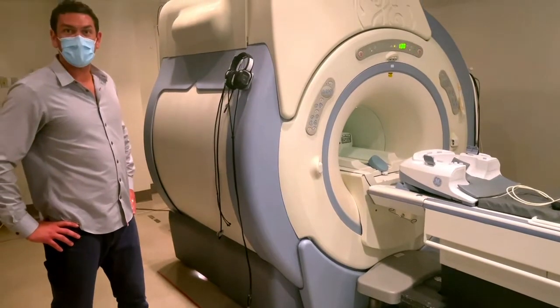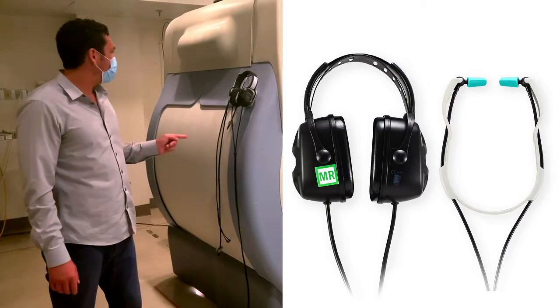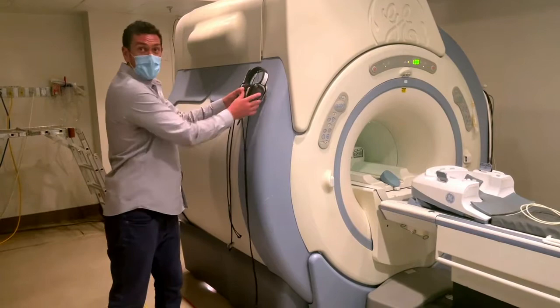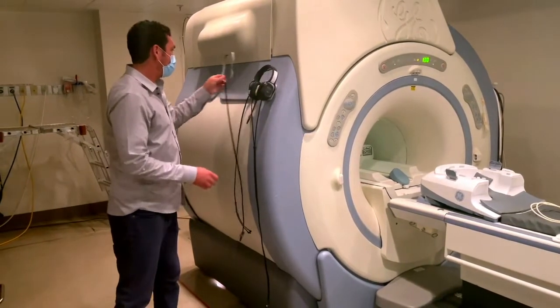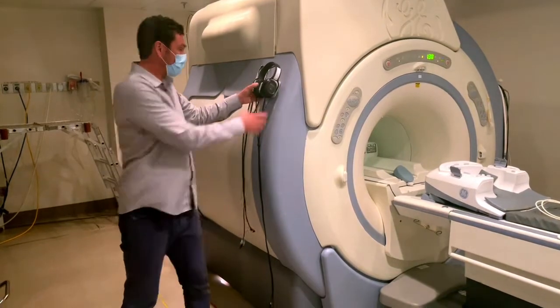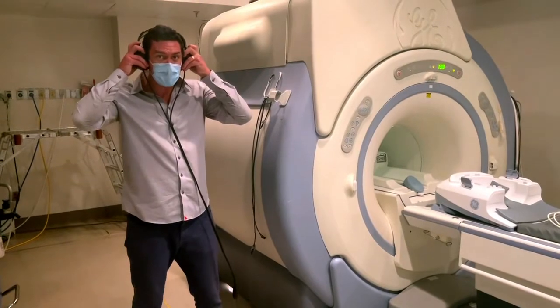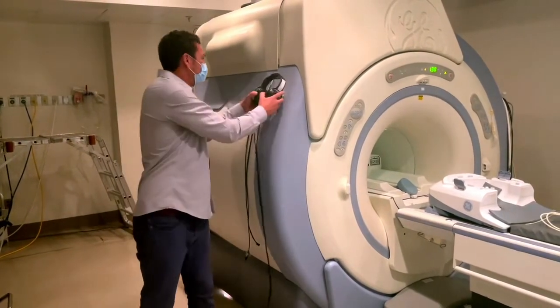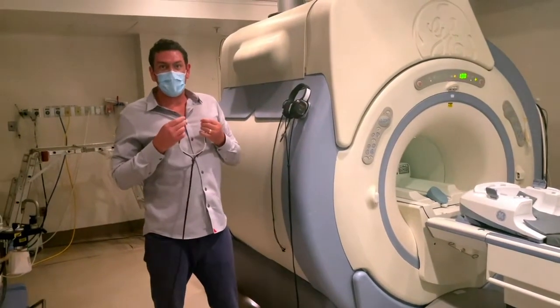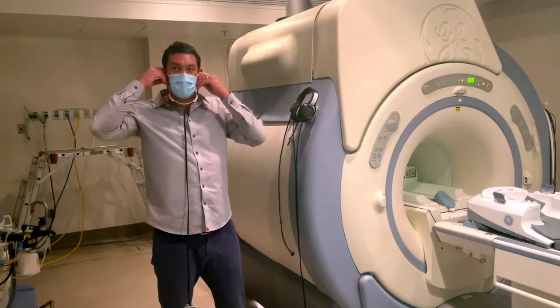The MRI audio system comes with two sets of headphones: over-ear headphones and in-ear headphones. Both headphones can be mounted on the side of the magnet. The over-ear headphones clamp onto the side of the magnet, while the in-ear headphones clip in. The over-ear headphones are best used for extremity scans since they take up a lot of space above the patient's face. The in-ear headphones are better for head scans and neck scans where you need a low-profile headset to fit inside the head coil.